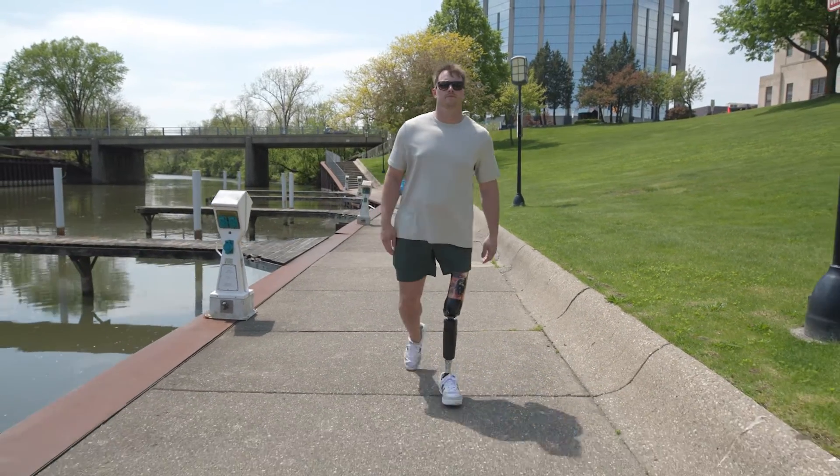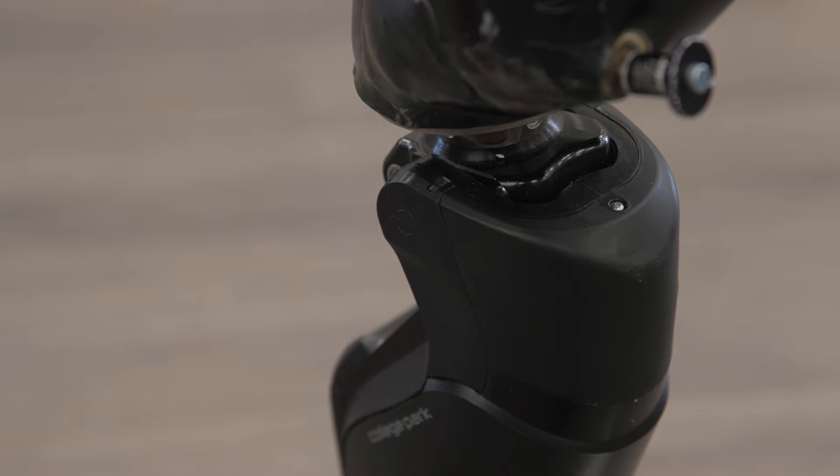The Icon is very easy to use with walking and changing your custom modes. There's an LED light on the knee that can show you what mode you're in, and there's also vibration so you can feel it throughout your socket when it's changing.